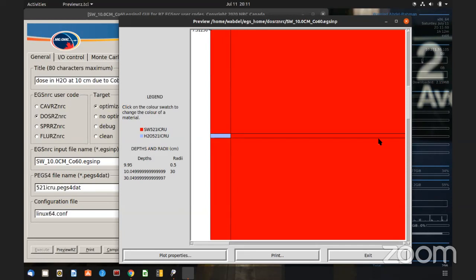Okay, no, I have a different view, I disagree with you, Bilal. So Bilal said, look, why do we need to put water within solid water, as Monte Carlo is capable of calculating in the medium itself? Moreover, this is only a relative calculation. No NDW is required. If you're doing PDDs, I have no problem.